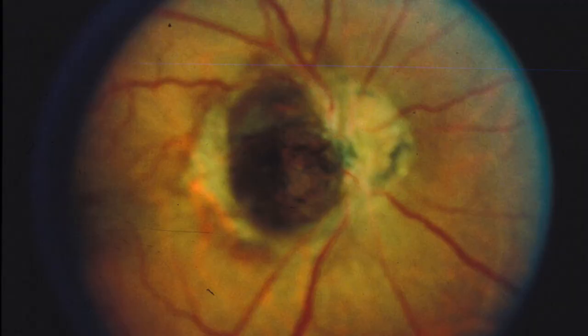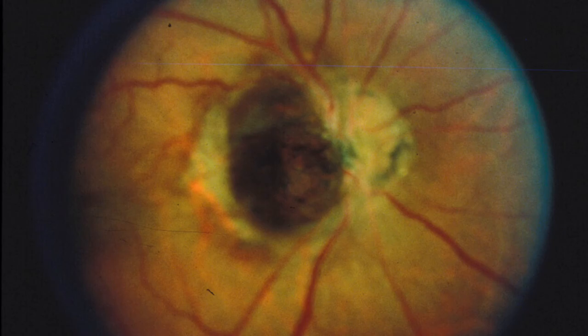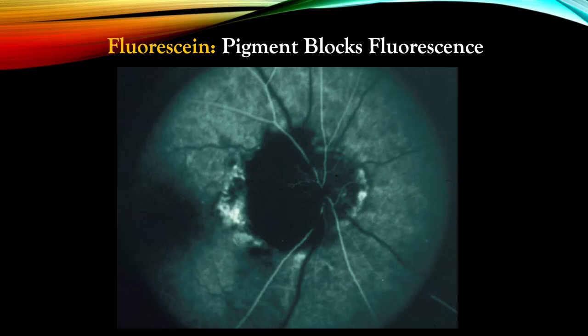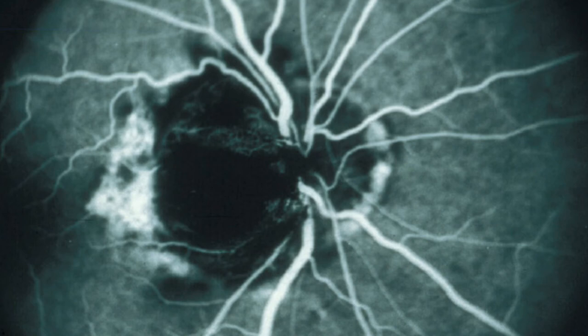Here is an example of an optic disc melanocytoma with brown coloration. It also has evidence of CNV along its nasal margin and hemorrhage below — these are rather atypical. In the early phase angiogram, the melanocytoma blocks fluorescence and is associated with choroidal neovascularization at its margin. The mid-phase angiogram shows some overlying intraretinal leakage with increased hyperfluorescence from retinal vessels. In contrast, the CNV is intensely hyperfluorescent at its margin.